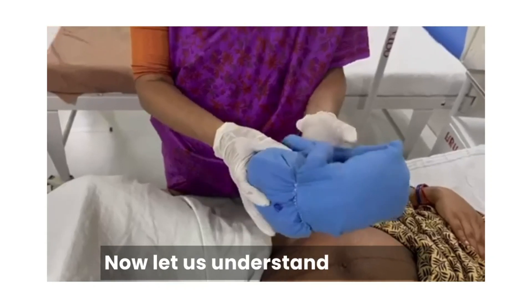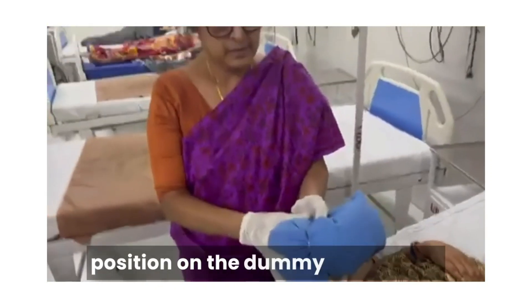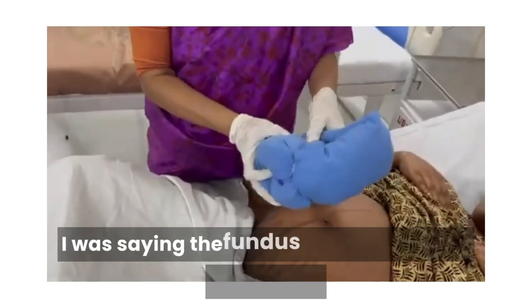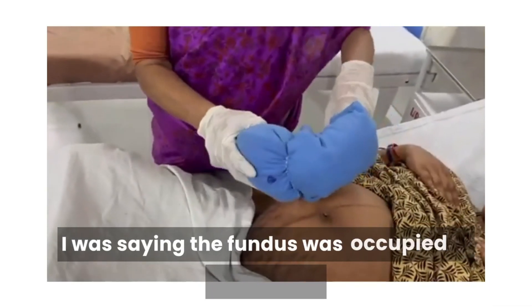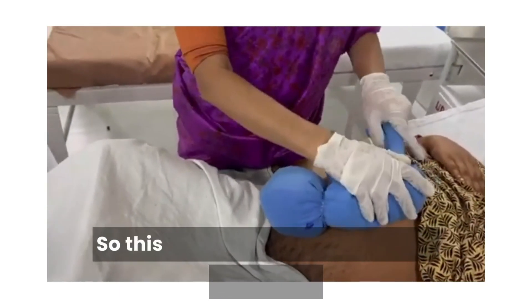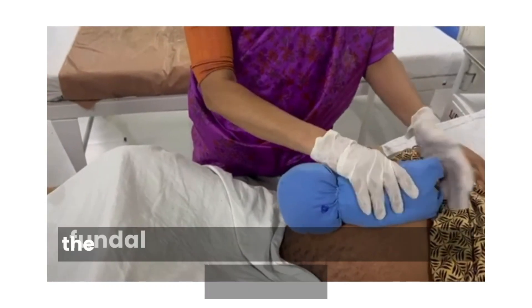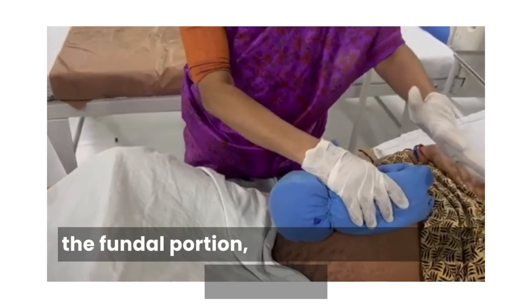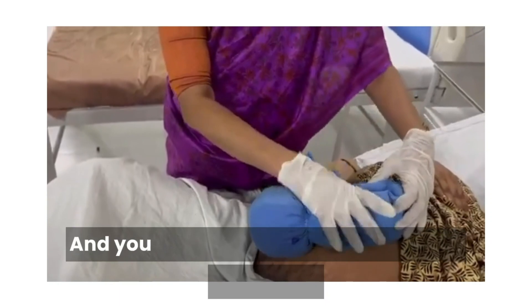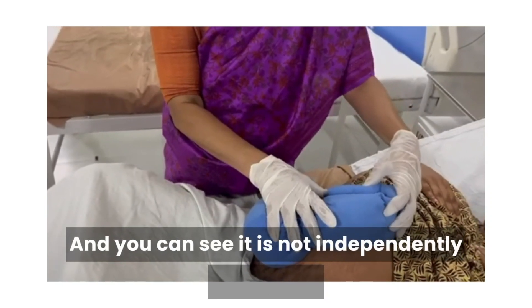Let us understand the same position on the dummy fetus. Here the fundus was occupied by the breech. This is the breech part occupying the fundal portion, which is broad and irregular, and you can see it is not independently ballotable.